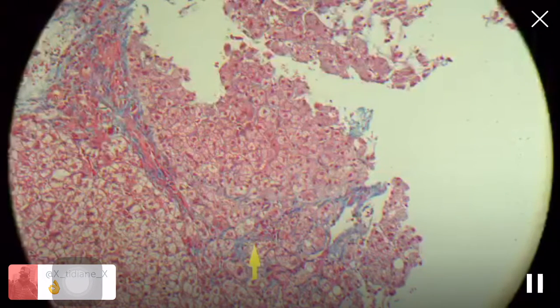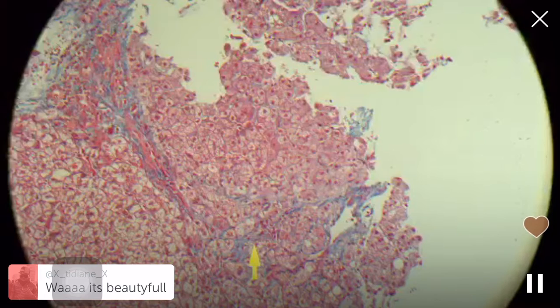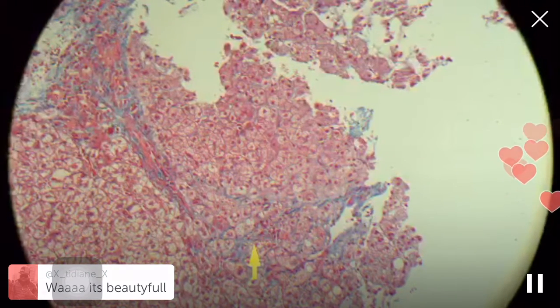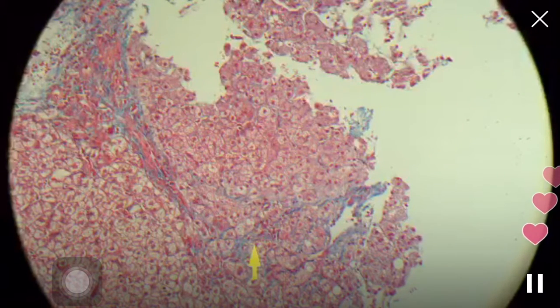So for this biopsy, features compatible with fatty liver disease, question mark, alcoholic versus non-alcoholic, even though they said NASH. I don't know. I'm relying on their clinical information. I'd rather just keep it neutral. Question mark, alcoholic versus non-alcoholic fatty liver disease, colon, and then I do 1, 2, 3. 1, steatosis, mild. 2, steatohepatitis, mild focal. 3, steatofibrosis, transition to cirrhosis. And that's my report. And that gives them all the information they need.